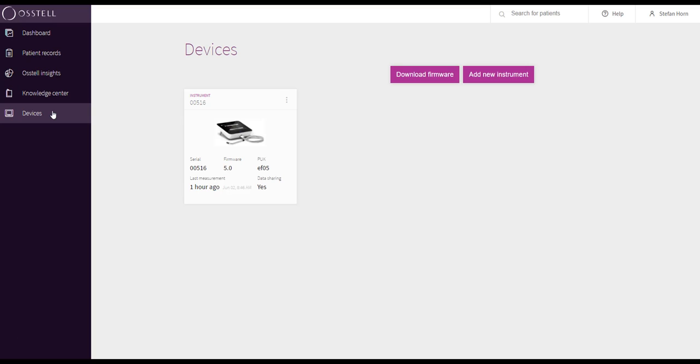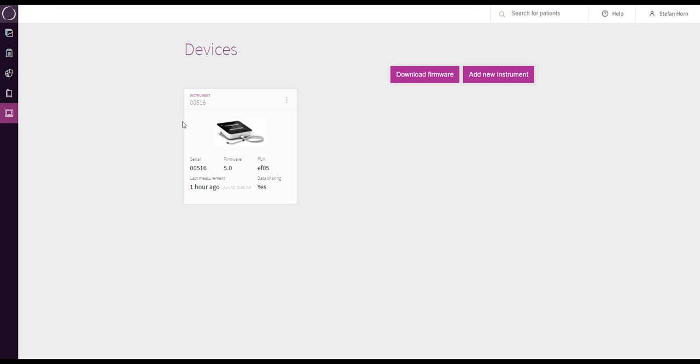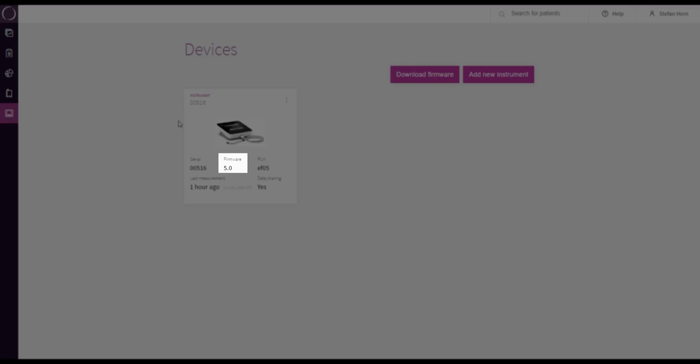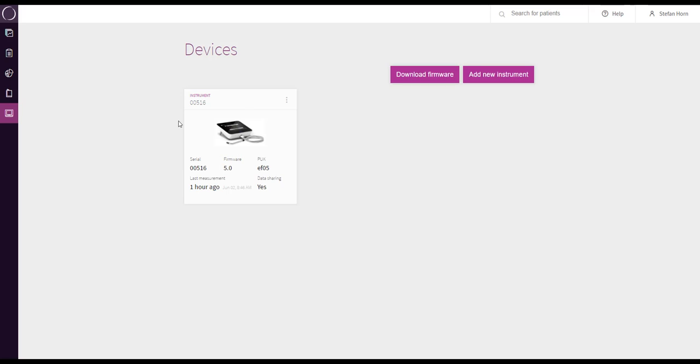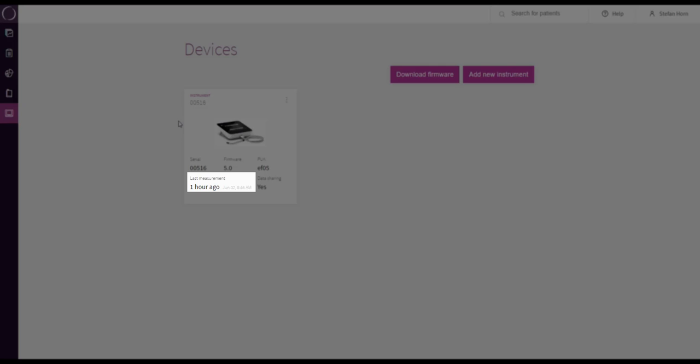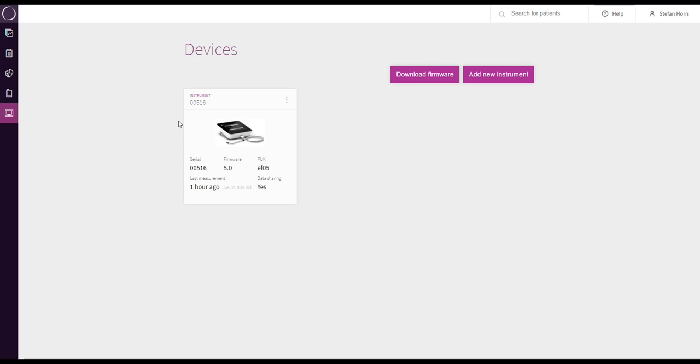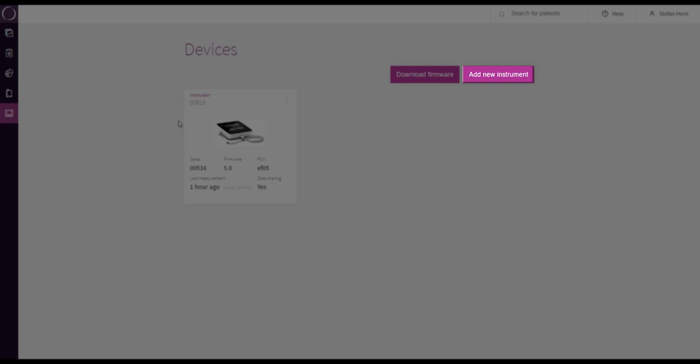The Devices tab helps you to get an overview of all your connected ISQ devices, such as version information and when the last measurement was performed. In this tab, you can add more instruments and also download new available software for your instruments.